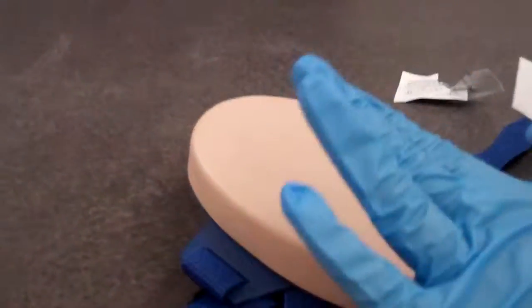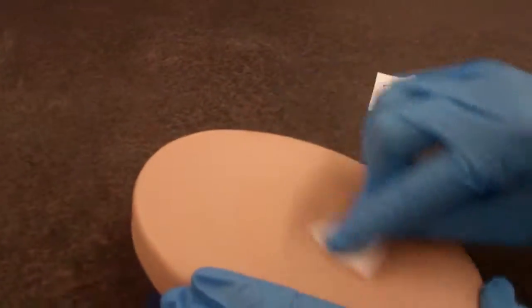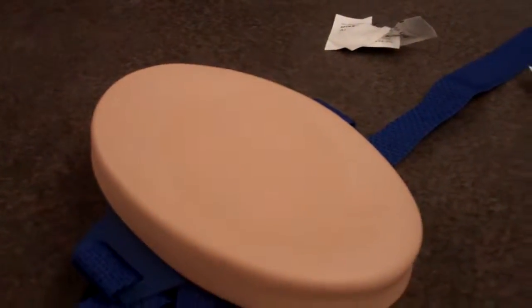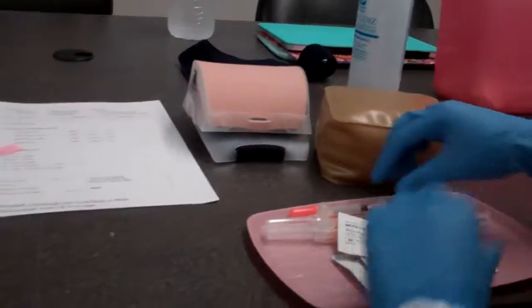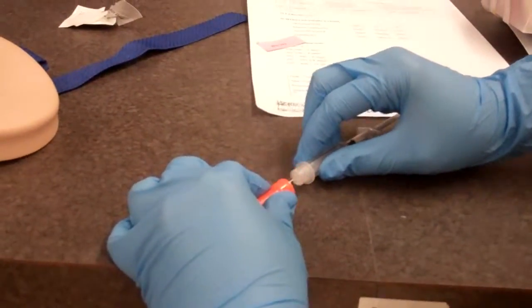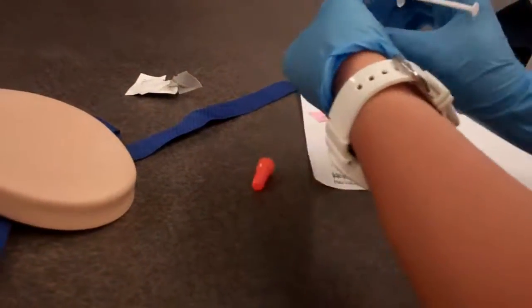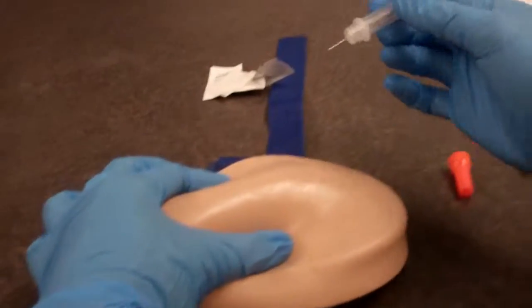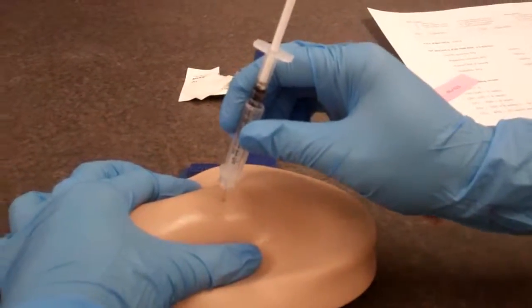I'm going to check the skin to make sure that it's intact, no lesions or trauma. I'm going to wipe it for 30 seconds in a circular motion. I'm going to let that dry, and then I'm going to uncap my insulin. Okay. Now I'm going to pinch the site and then inject like a dart.